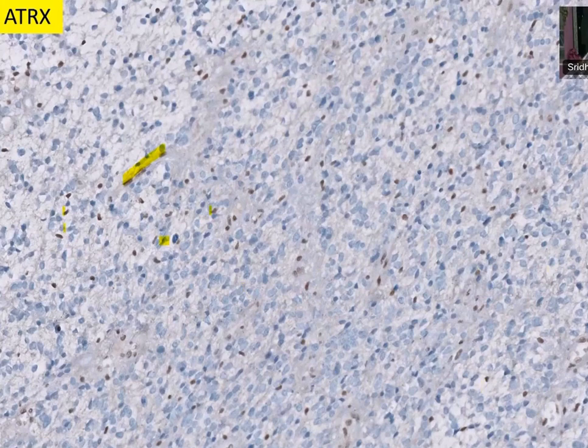You can see the predominant cells are negative. Yes, sir. And in between, these are normal cells, and you can see this is a vessel here. Endothelial cells are positive, and this is all vessel. This is also vessel. Some scattered single cells are there, but the predominant cells are negative. So this is a perfect case which is showing loss of expression for ATRX.